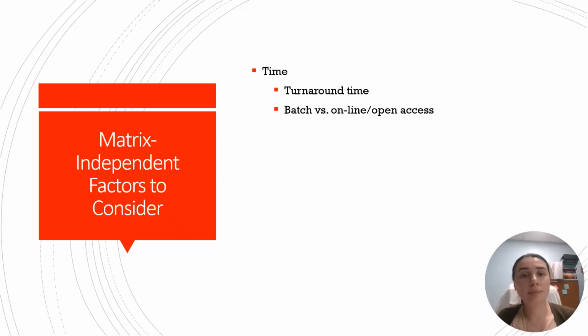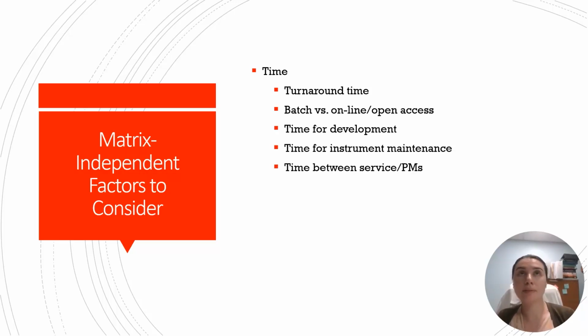Other factors, time, and that is turnaround time. Are you going to batch your samples? Are you going to have online or open access analysis? Time for development, more complex sample preps require more development. Time for instrument maintenance. The more intricate your sample prep, the longer you're going to have between having to perform maintenance on your instruments. Time between service and PMs in the same line with instrument maintenance. This is more involved instrument maintenance.